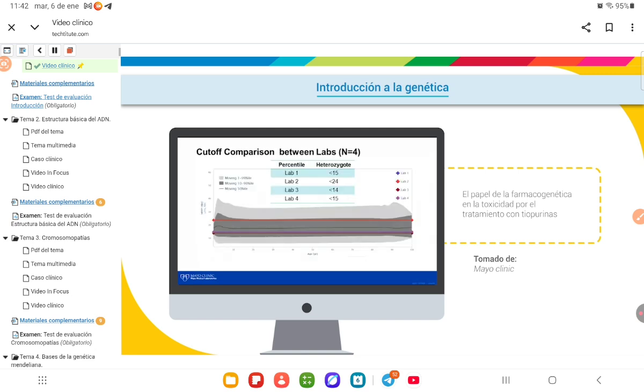Shown here is a comparison of heterozygote status decision point among 4 laboratories performing comparable one substrate TPMT assays. The background is a representation of moving percentiles that will be discussed later. While one lab appears to be substantially different, our lab and 2 others were very close, indicating that the overreaching decision point was not an issue unique to our practice.